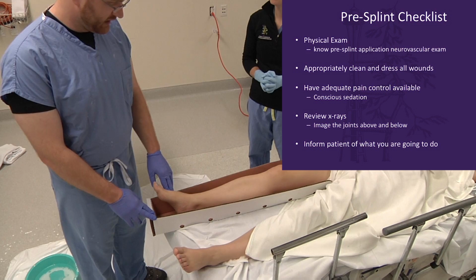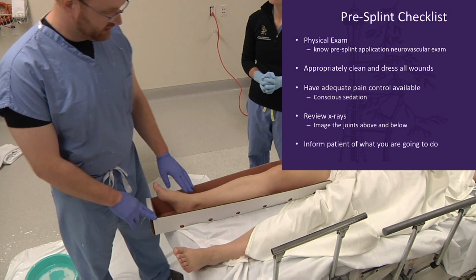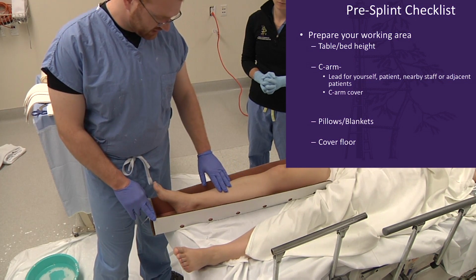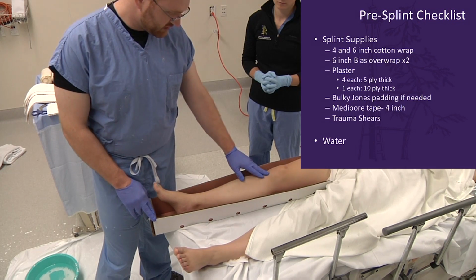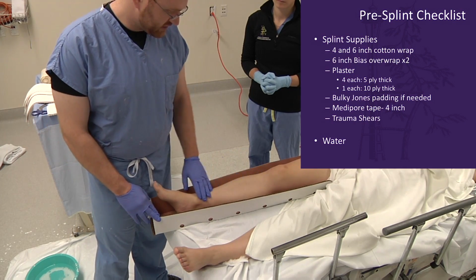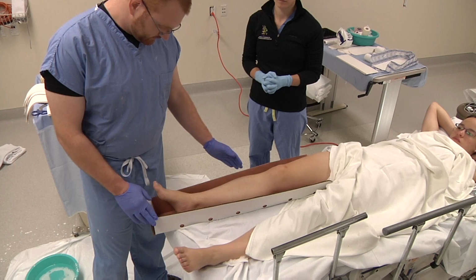We're going to be applying a long leg splint. This is commonly seen in anything where you need stability above the knee for any rotational issues. Primarily, we use this for tibia fractures, tib-fib fractures, plateau fractures, or pilons even, where there's going to be rotational instability if you just splint with a short leg splint.